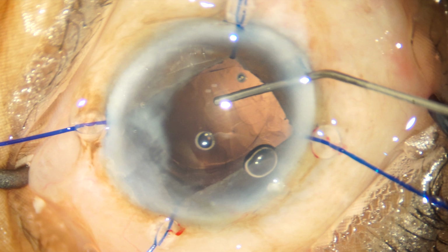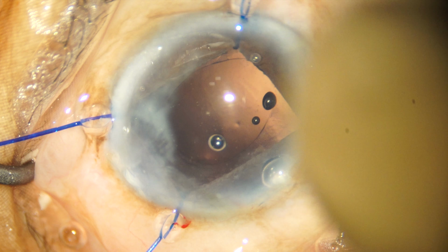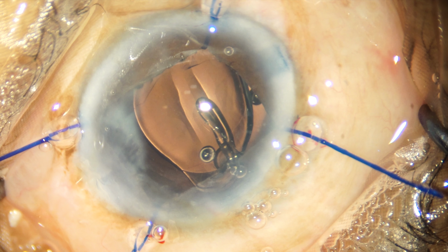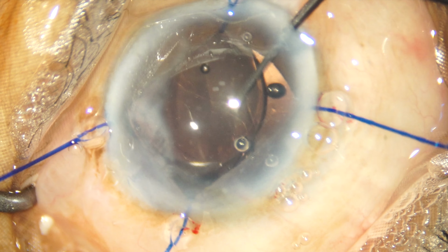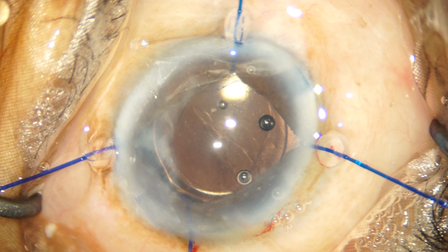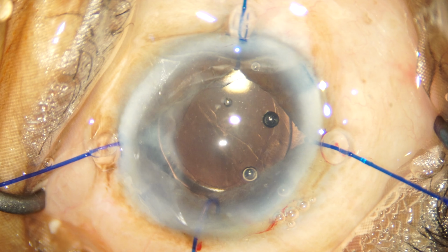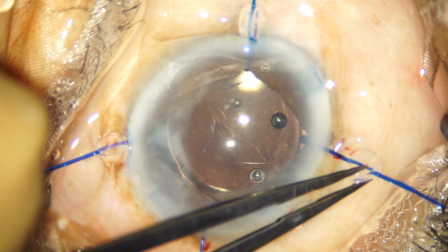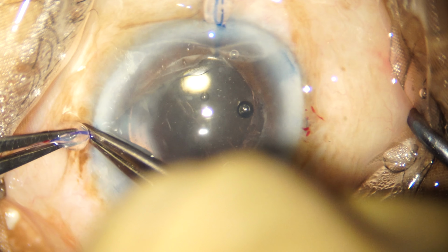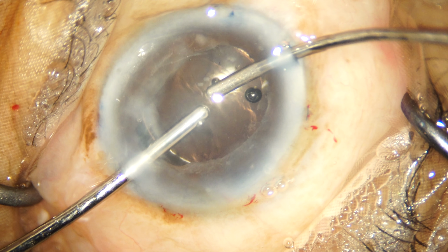We're now reinflating the bag with sodium hyaluronate and preparing for IOL implantation. With the Y dialer, I nudge the IOL into the bag, and once I'm satisfied that the IOL is inside the bag, I go ahead with the removal of the iris hooks. Once all the iris hooks are out, I go ahead with aspiration of the viscoelastic substance.